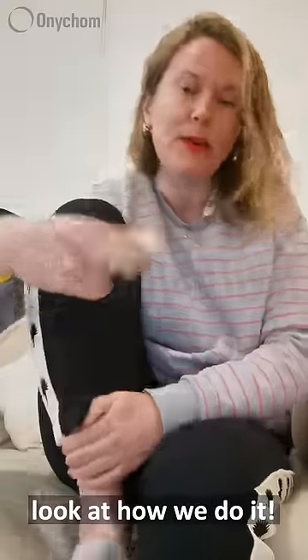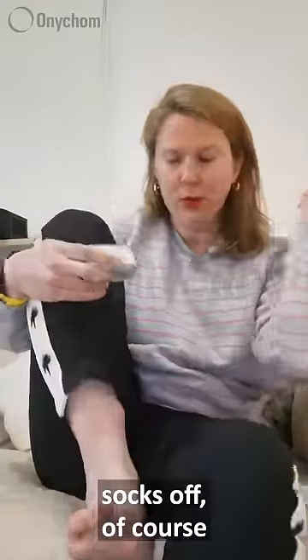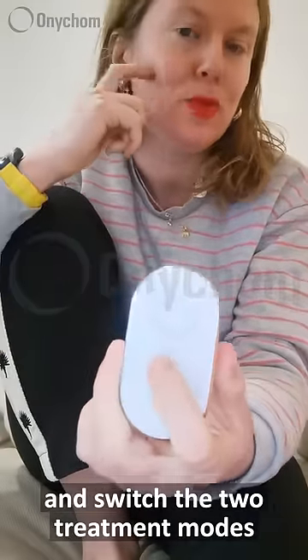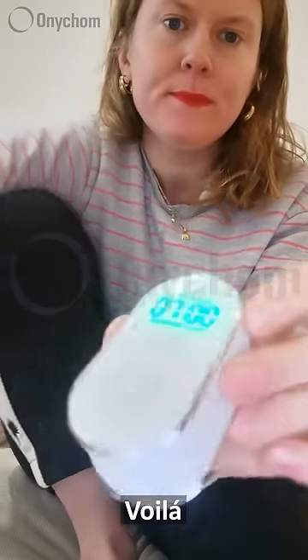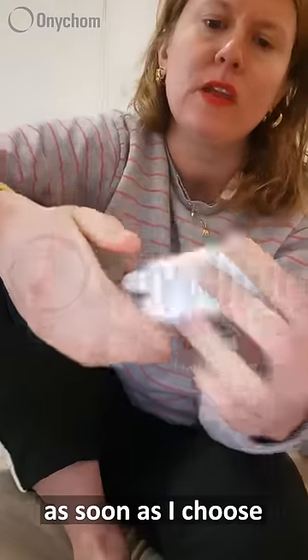So let's look at how we do it. Let me show you my toes — socks off of course. We turn it on and switch between the two treatment modes by the on/off button. See here — voilà. You'll see that it starts doing the countdown as soon as I choose.